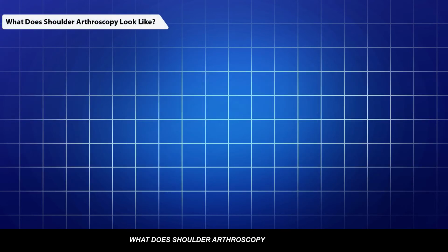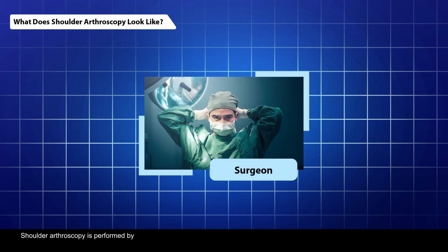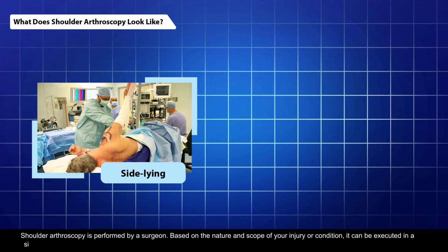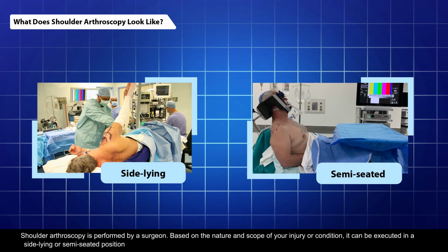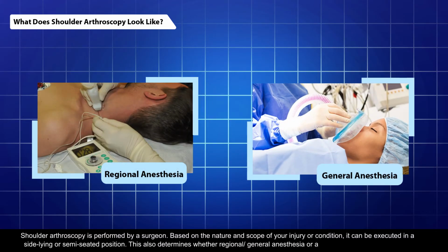What does shoulder arthroscopy look like? Shoulder arthroscopy is performed by a surgeon. Based on the nature and scope of your injury or condition, it can be executed in a side-lying or semi-seated position. This also determines whether regional or general anesthesia or a combination of both is needed.